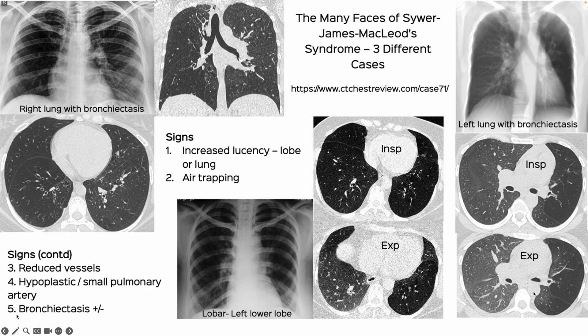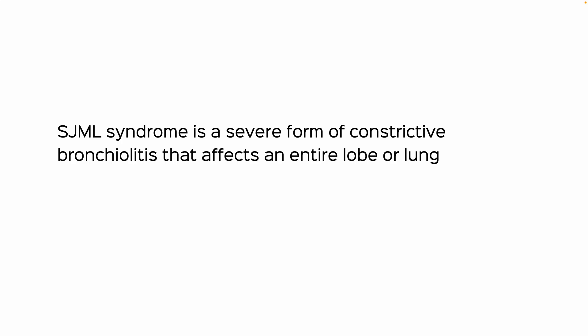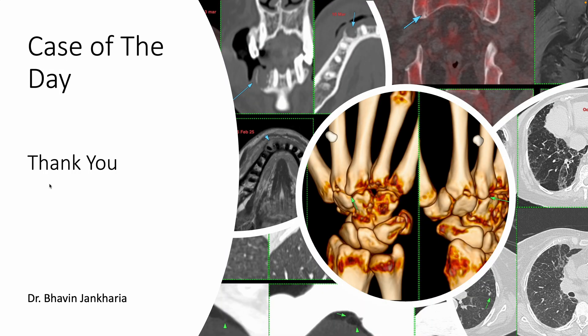These are three different Swyer-James MacLeod syndrome cases. The first is the index case. The second is one I saw almost two decades ago — you can see a very subtle small left lung on the radiograph, but on the expiratory images the left lower lobe shows increased lucency, paucity of vessels, and marked air trapping. The third patient also has increased lucency on the radiograph with marked increased lucency, paucity of vessels, and air trapping on expiratory images. It's a severe form of constrictive bronchiolitis affecting an entire lobe or lung. That's the link to my WhatsApp channel — thank you for listening and viewing, take care.